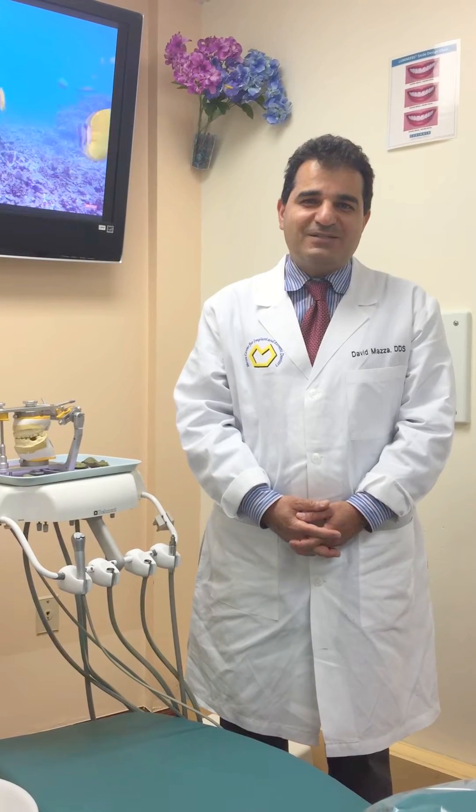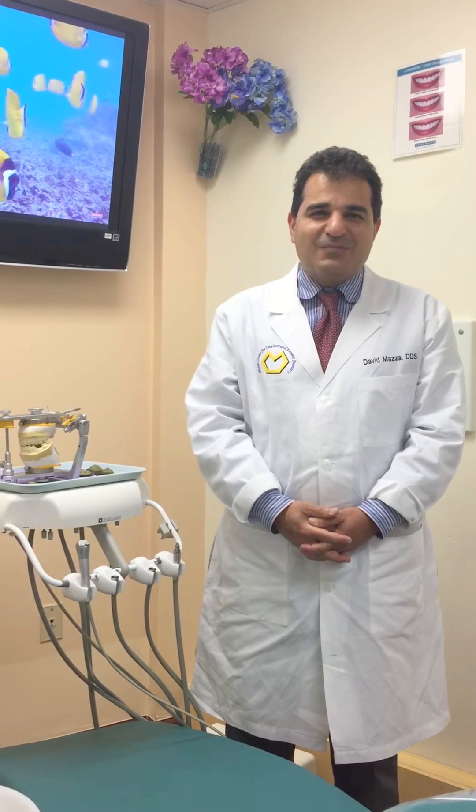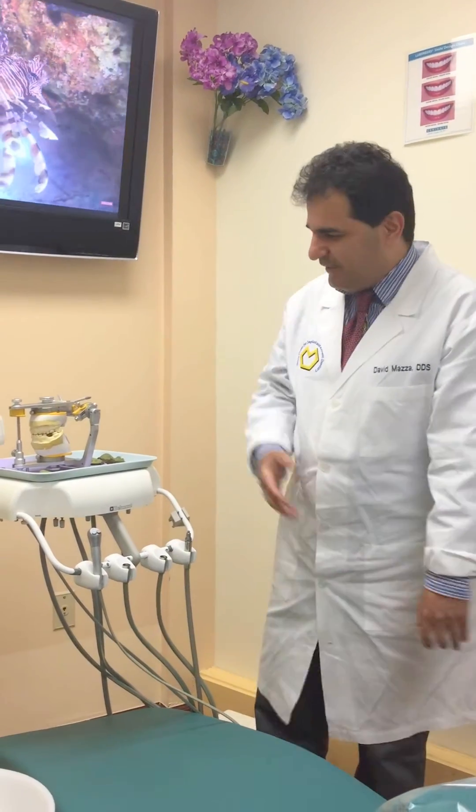Hello, this is Dr. David Mazza and today I will be talking to you about setting the Condylar Inclination Angle and also Bennett Angle on the SAM3 articulator.